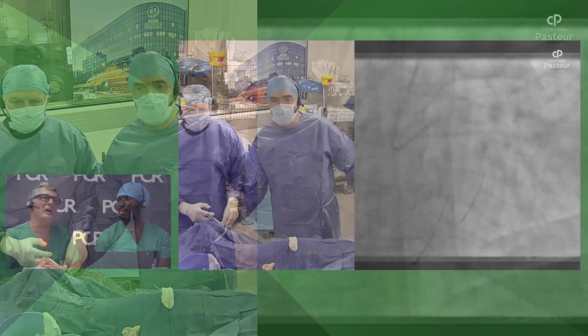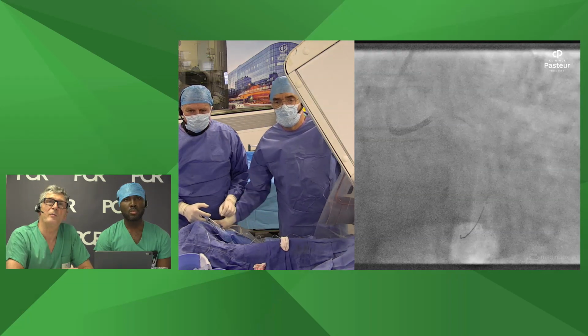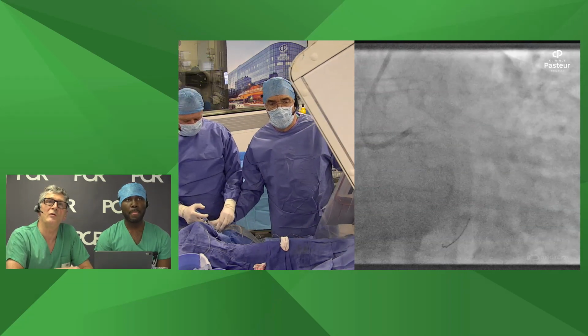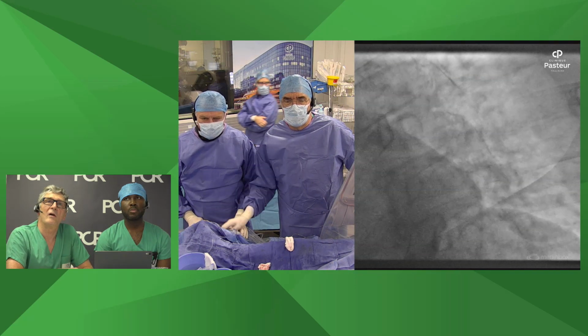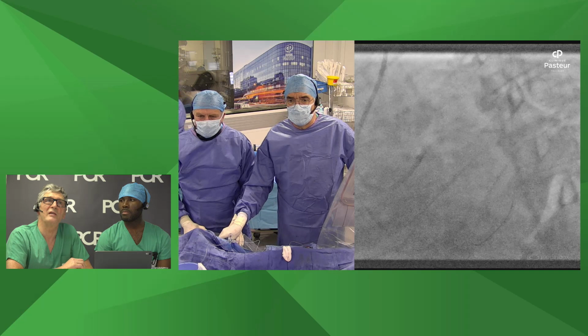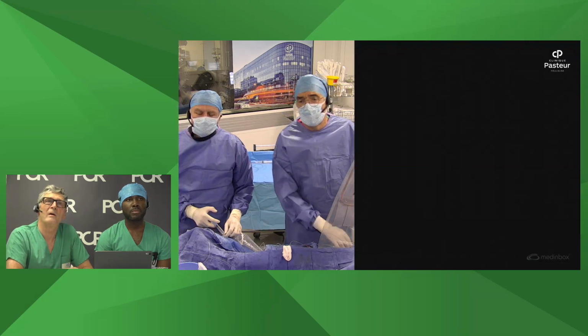Of course we can discuss about intracoronary imaging. So what is your opinion? In this case, should we do it during the procedure, after stenting, or only when you think that there is something which is going wrong or something not clear?